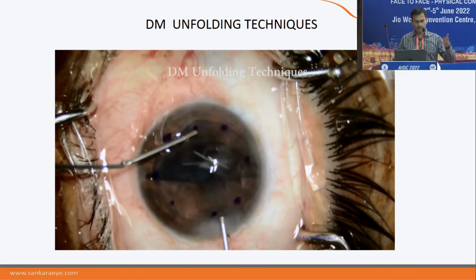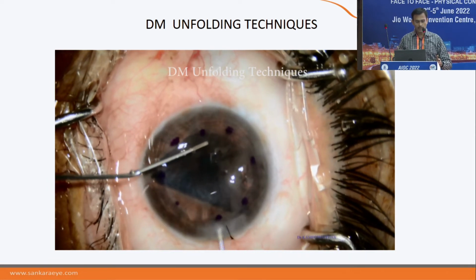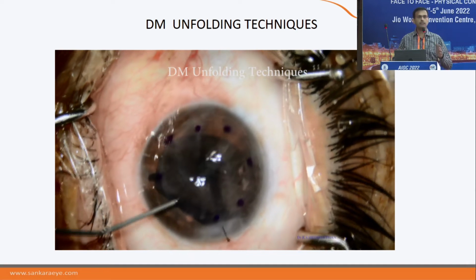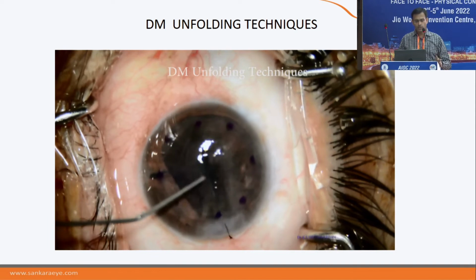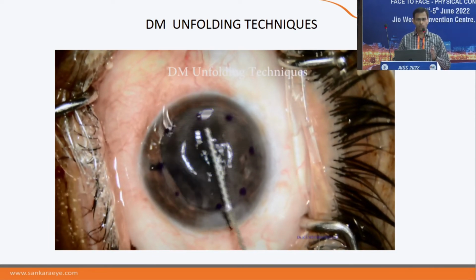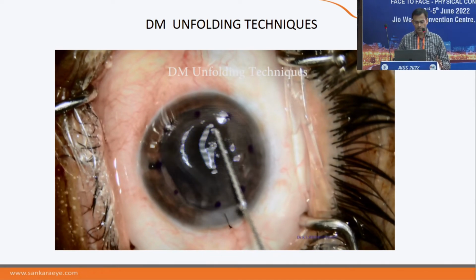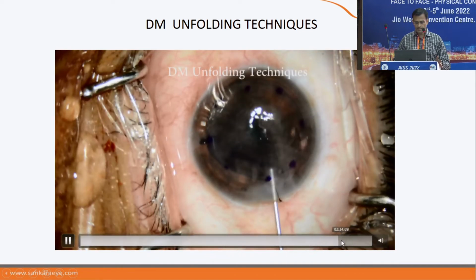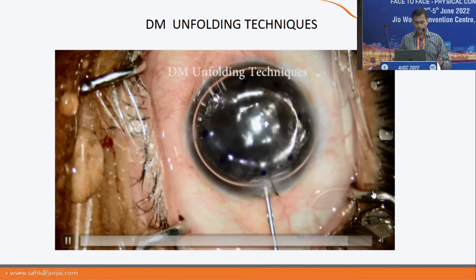Where with the left hand I hold, and with the opening I inject saline, I shallow. I inject saline, I shallow. See, that's the technique. Now it's very, very smooth and it unfolds very well. The only thing is, you have to make the tissue lie horizontal always. Don't make it vertical. If you're sitting temporal, always make it horizontal, so that it's very simple and it stands in.